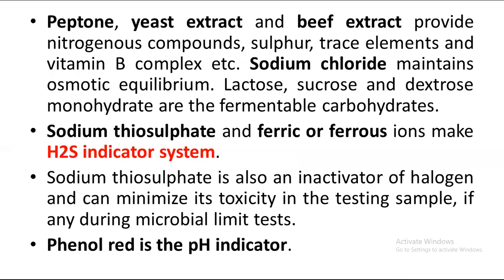Sodium thiosulfate and ferric or ferrous ions make H2S, and the production of H2S is also an indicator produced by specific bacteria. Phenol red is used as a pH indicator, and sodium thiosulfate is also used to minimize the toxicity to the microorganism. So these all were the composition of it.